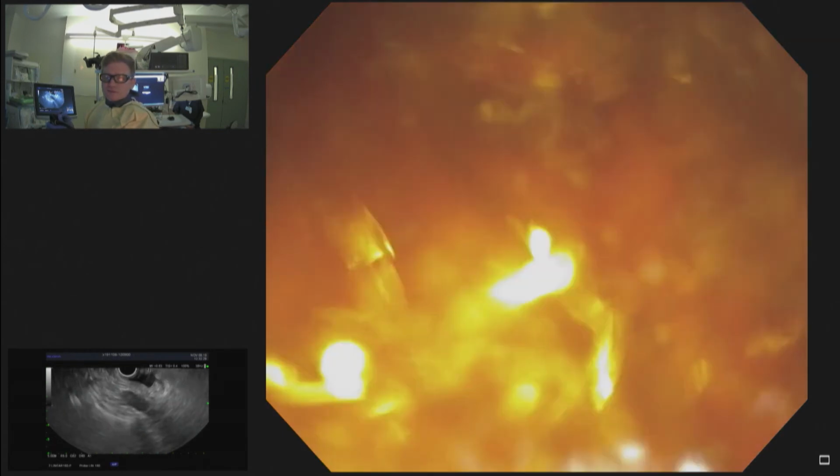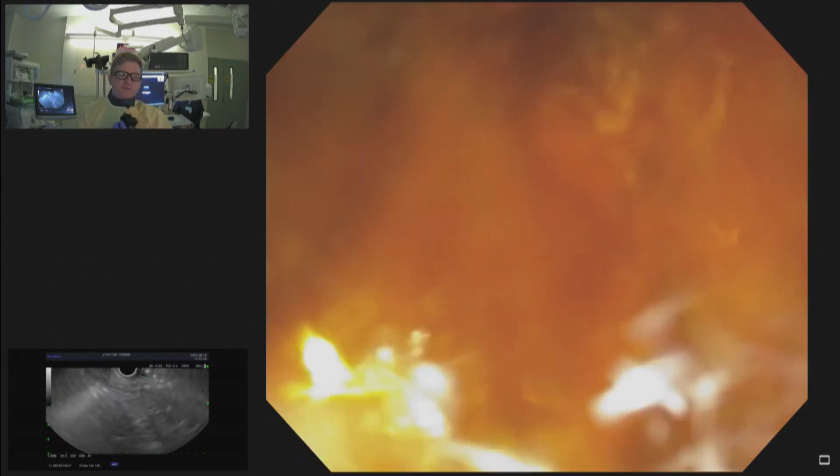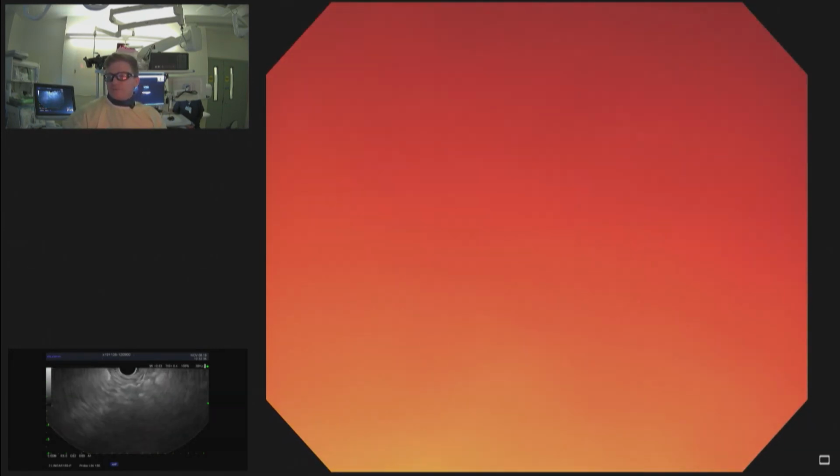So I think then, we'll finish up the exam here for thoroughness sake, but we can switch over to Dr. Bidmuller's next case, and we'll start with the case presentation for that.